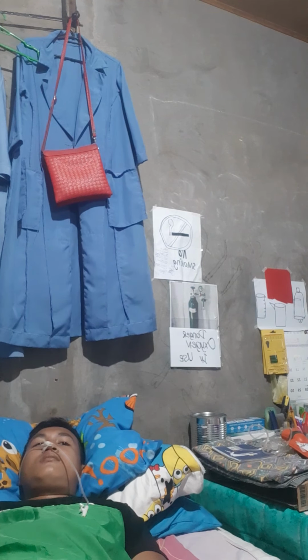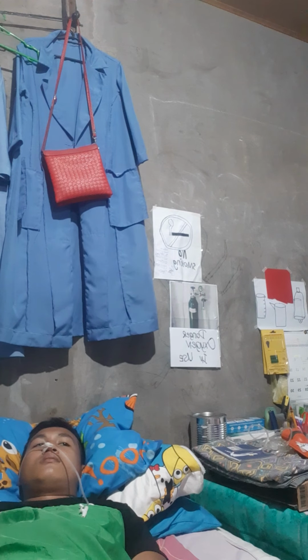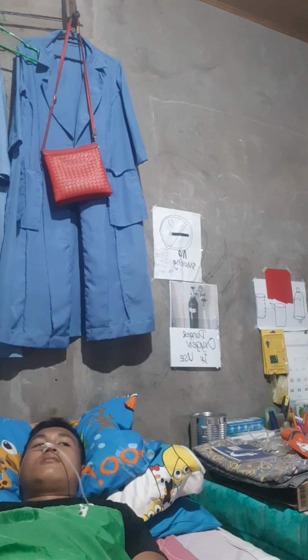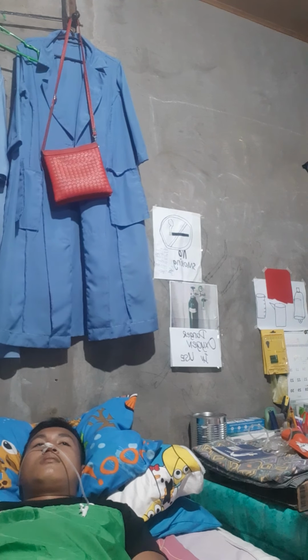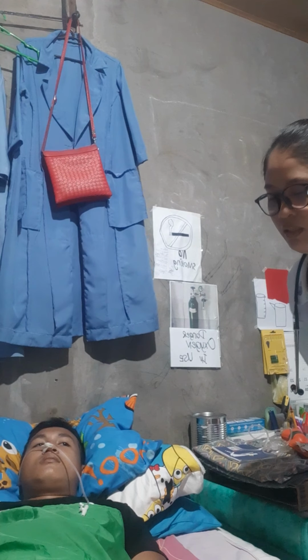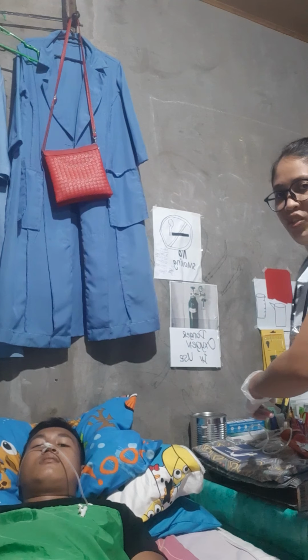Then allow 1 hour to elapse before testing the pH if the client has received medication. But for now, the client is not receiving any, so we can test it with the pH papers.